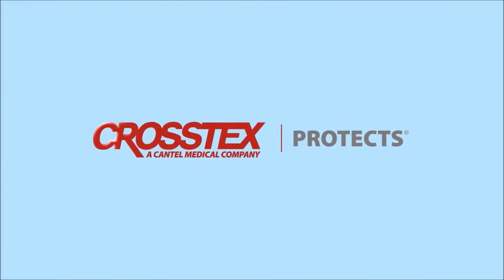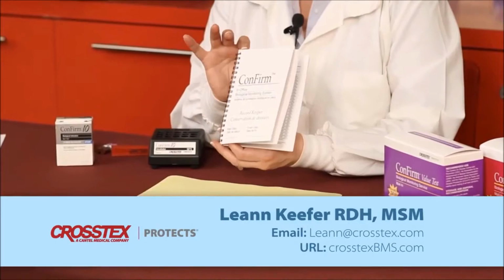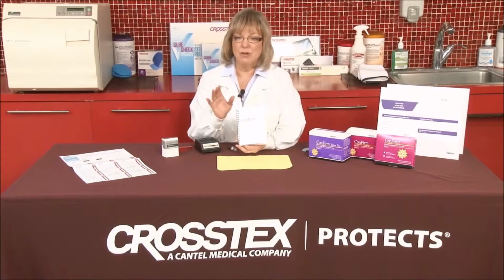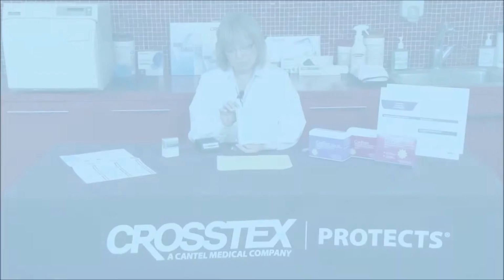We've been talking about biological monitoring, and this is the last step in the process, but it is incredibly important that we complete this part of the process because we want to be able to keep records of all of our testing, and it's something that if an office should ever be audited, it might be one of the first records that you're asked to produce.